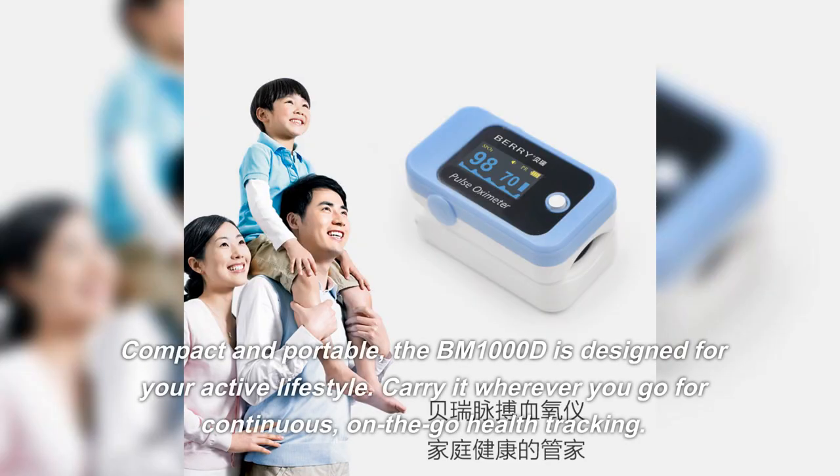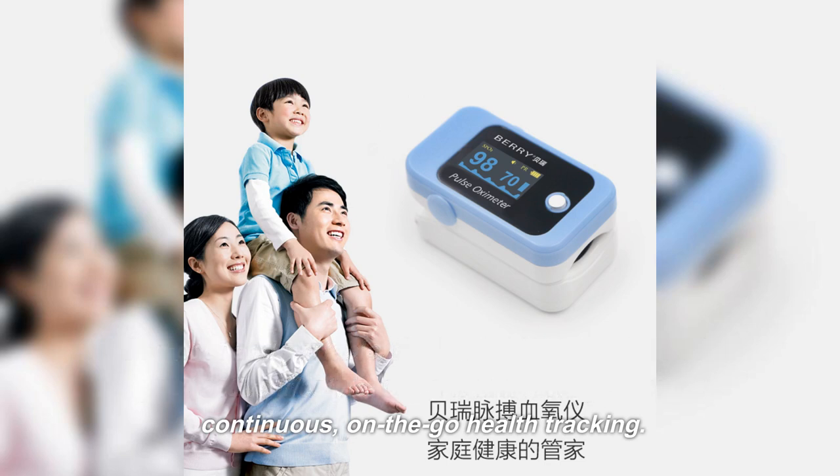Compact and portable, the BM-1000D is designed for your active lifestyle. Carry it wherever you go for continuous, on-the-go health tracking.